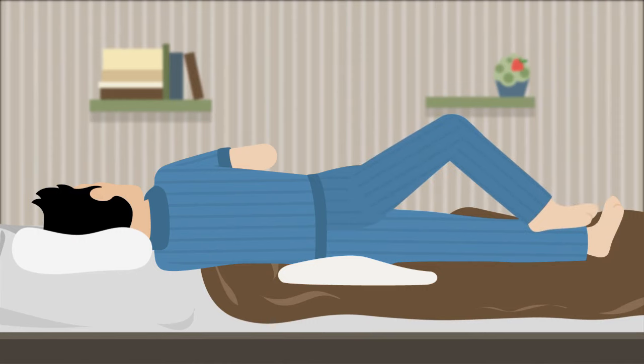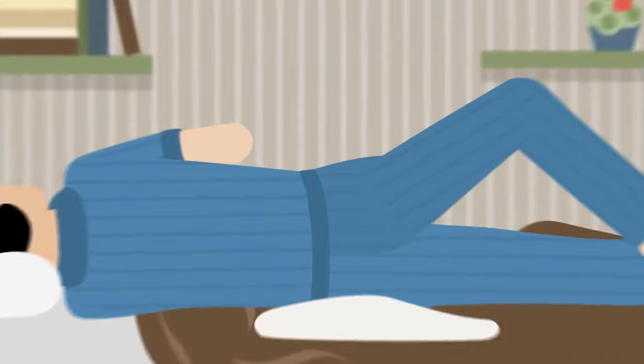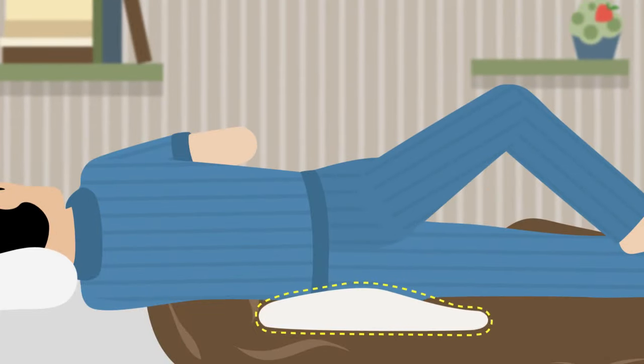Lie down on the left side with your left leg stretched and your right leg bent. You can put a pillow under your left hip for the enema contents to get to the descending colon, which is on your left side.